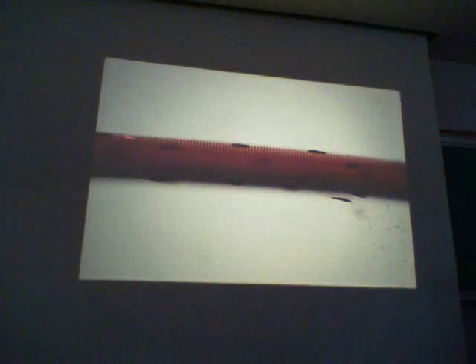Okay, what's this tissue? Skeletal muscle. This is one of those teased fibers. This is an entire fiber that's been laid down on a microscope. And this tissue, skeletal muscle in section. You see the striations, you can see the connective tissue investments, and those peripheral nuclei.